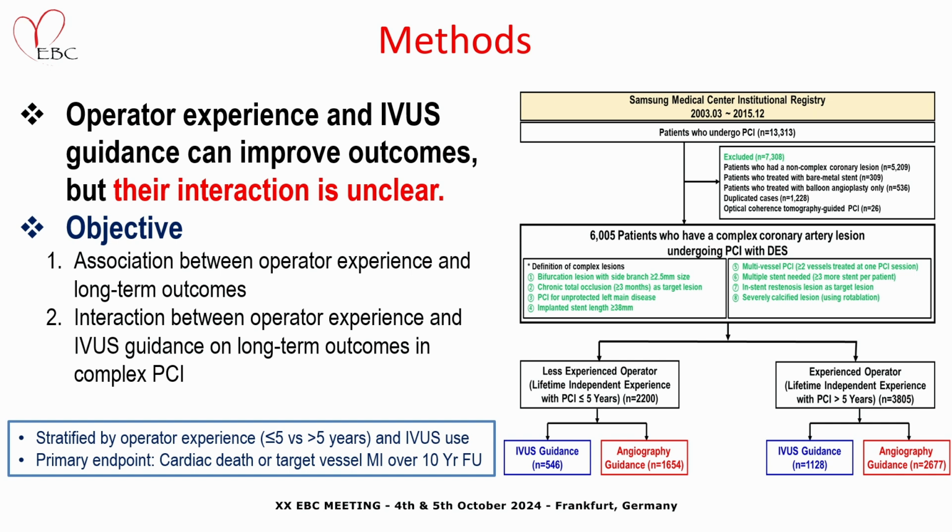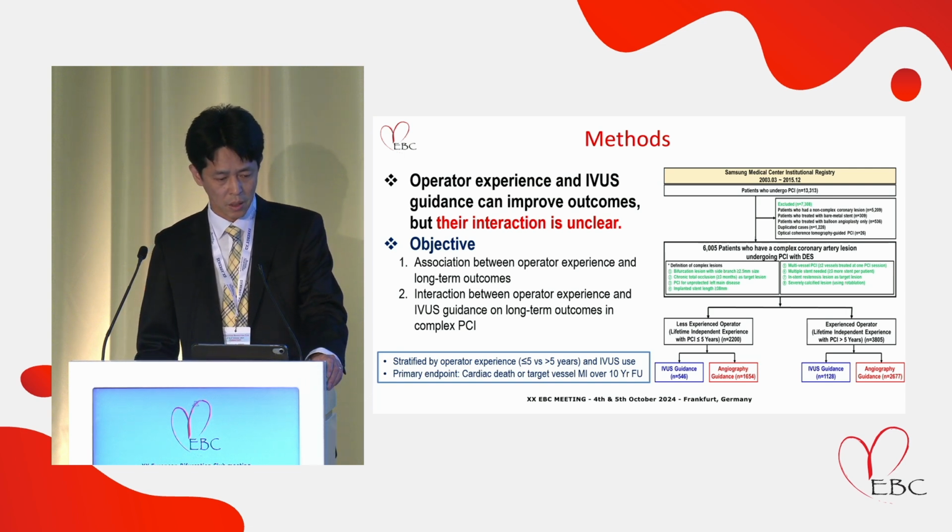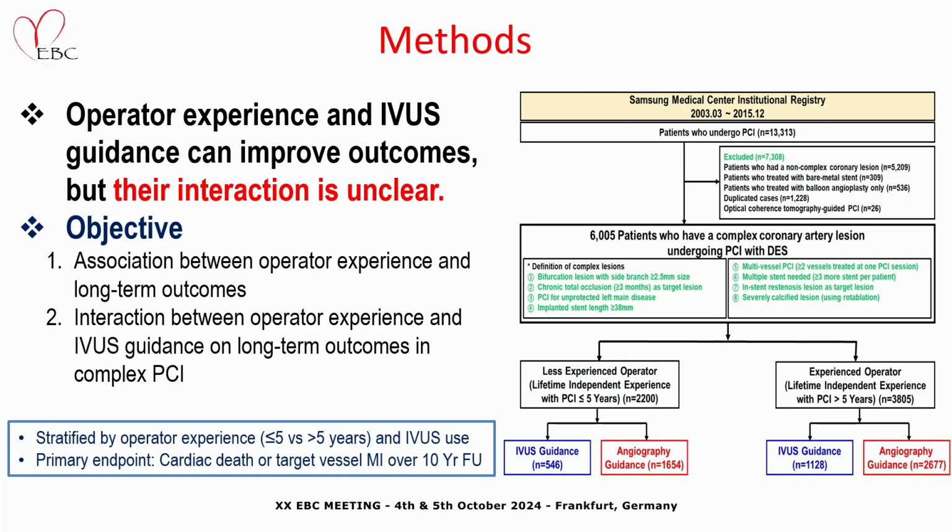So we analyzed data from more than 6,000 patients who had complex coronary artery lesions undergoing PCI with drug-eluting stents at Samsung Medical Center. We stratified the data by operator experience, less than 5 years versus over 5 years, and IVUS usage. The primary endpoint was cardiac death or target vessel myocardial infarction over a 10-year follow-up period.